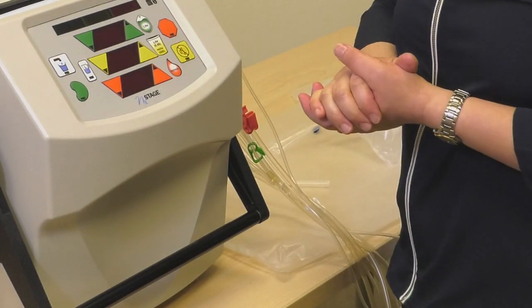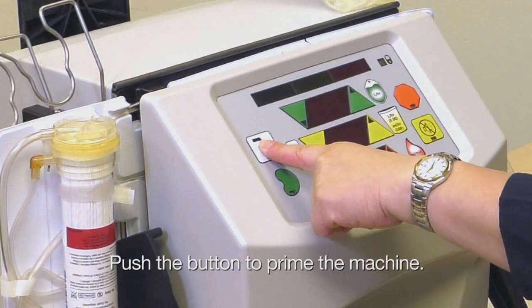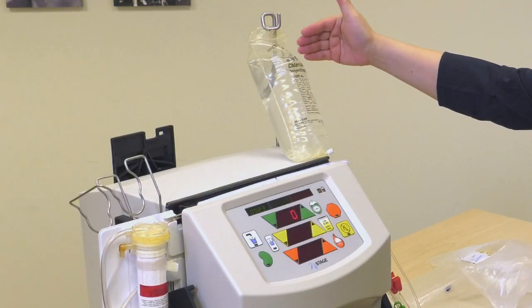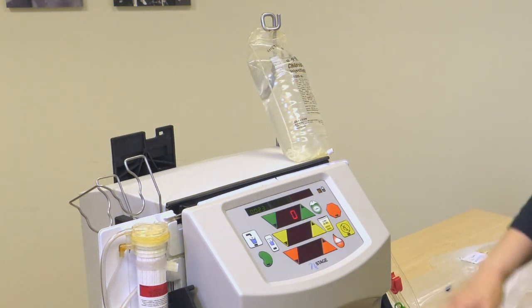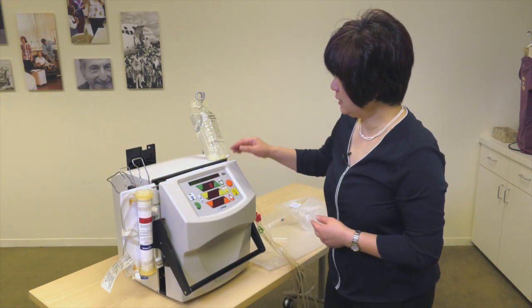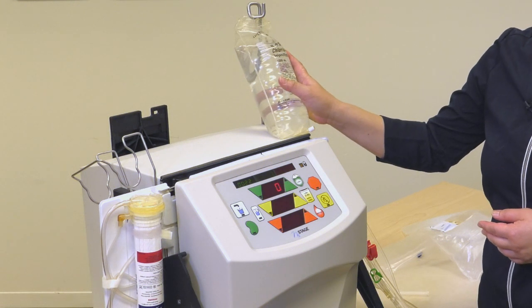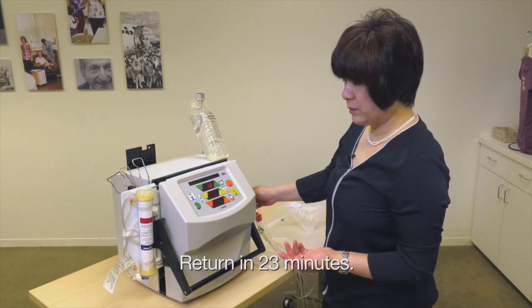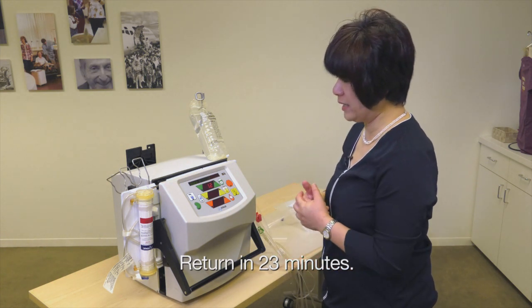In order to prime, I just have to push one button. The priming has started. The machine will deliver the saline from the saline bag, fill up all the tubings and the dialyser. The air that got expelled will go back to the saline bag, so there's no air exposure. And it's going to take 23 minutes, so the patient doesn't have to stay here and watch — they can just go away and come back.